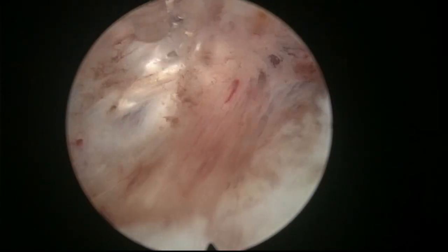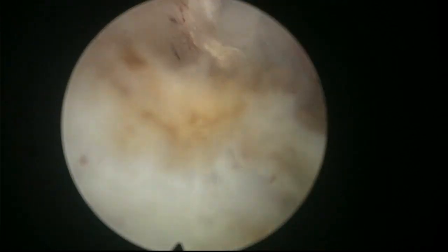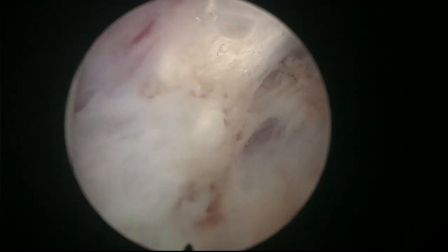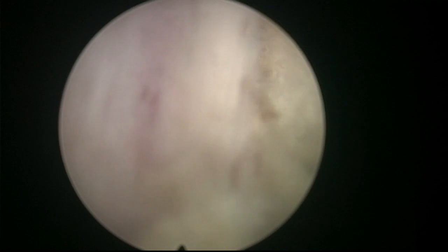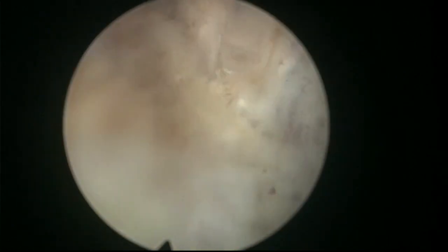It's a bleeder. We try to control it to get good visibility, but you see that the beautiful aspect of this technique is that we are irrigating a very small cavity, and by irrigating this small cavity, we can have a clean view, because even when there's some bleeding, as we saw before, the water is coming in and out very fast and cleaning the irrigation media, so we can perfectly see throughout this enucleation phase. Many times with a three-lobe technique, when you cut the middle lobe and you throw it into the bladder, if there is bleeding, the blood is going to circulate into the bladder and then come out. Taking it out is going to be much more difficult.